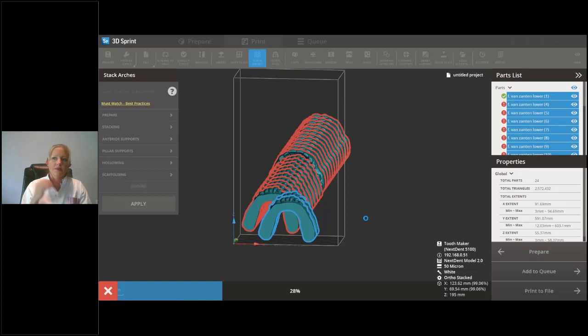And we wanted it to be strong, so we kept thermoforming until we made sure that we had a very solid model. So we filled the teeth, but we got rid of all of the solid area. We made a nice 1.5 millimeter model wall to save material. And we also put a lattice structure in there, and you'll see that here in a minute. It takes just a second to calculate, for strength and stability as it's printing.